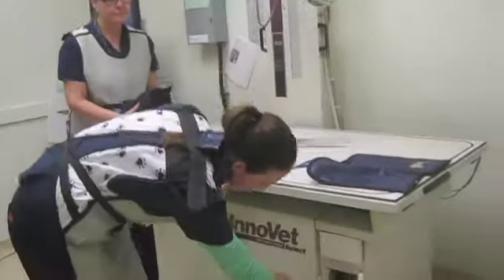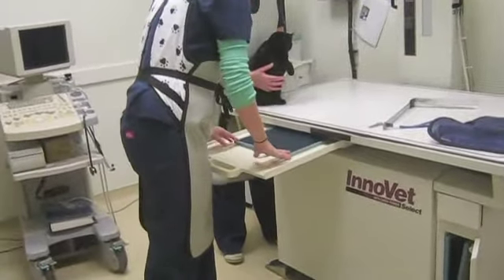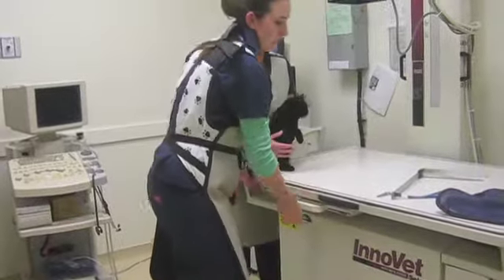For the x-rays, we measure the patient while in the lateral and VD positions at the location of the last rib.